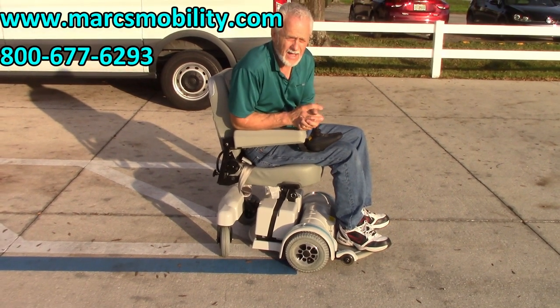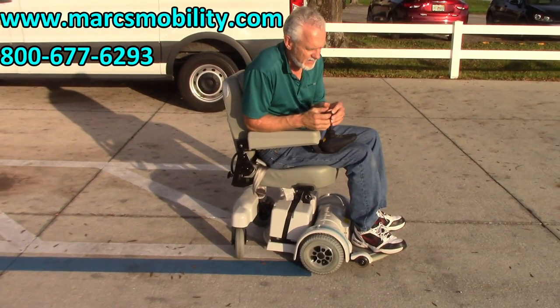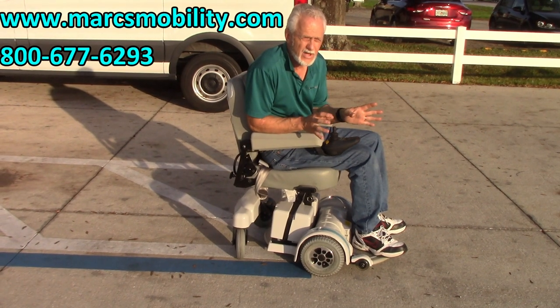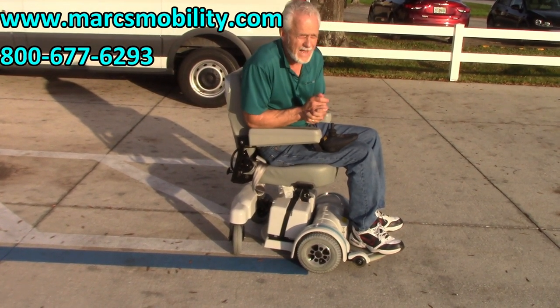It's the Hoveround MPV5. It's been a great chair for over 25 to 30 years, synonymous with quality, built in the US. We sell a lot of these and we never have any issues with them, unless someone goes in the lake with them. But other than that, they're really good.